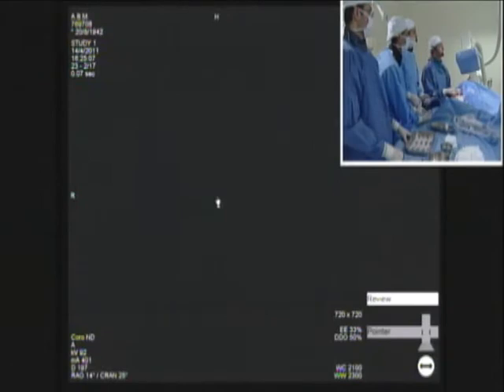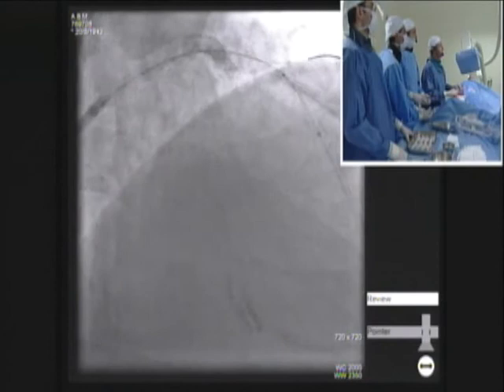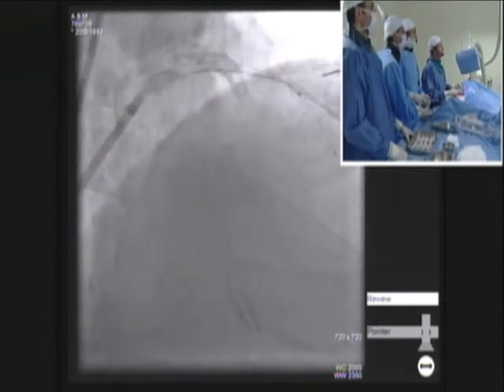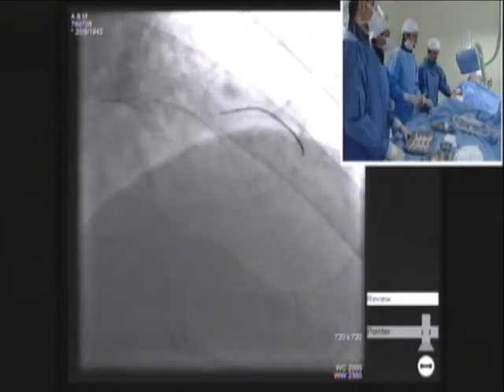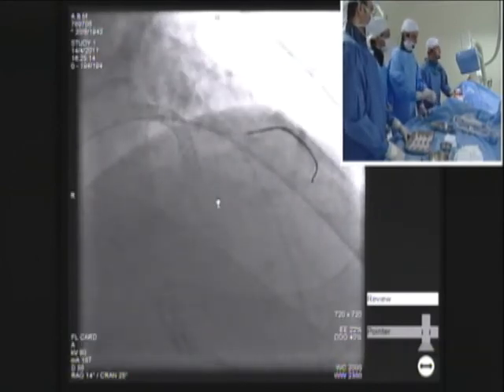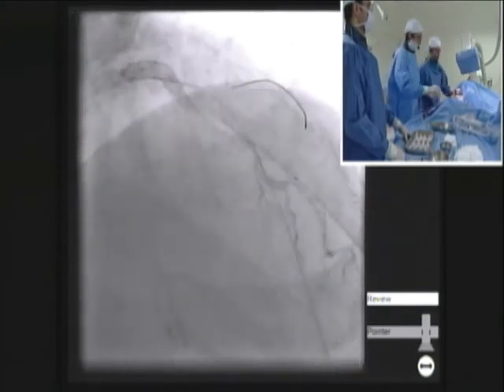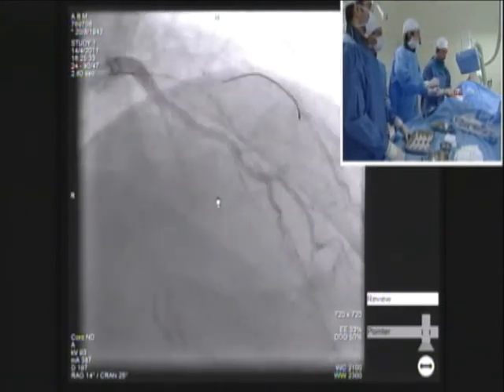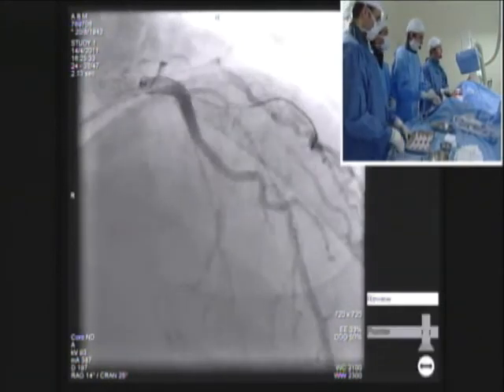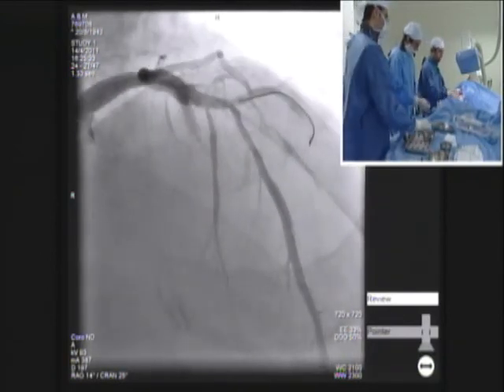I think the LAD is a calcified artery, too calcified. I think IVUS is mandatory in this intervention prior to deploying the stent. I would say highly recommended. Mandatory. There is no stent indication. If you ask Fausto, he would say that he can do it without. No, I can do it with angio. I have a case from China to show you. We had a long discussion in China a few weeks ago on that. But I think IVUS is helpful, but it's not mandatory. I mean, it's a recommended thing to do.